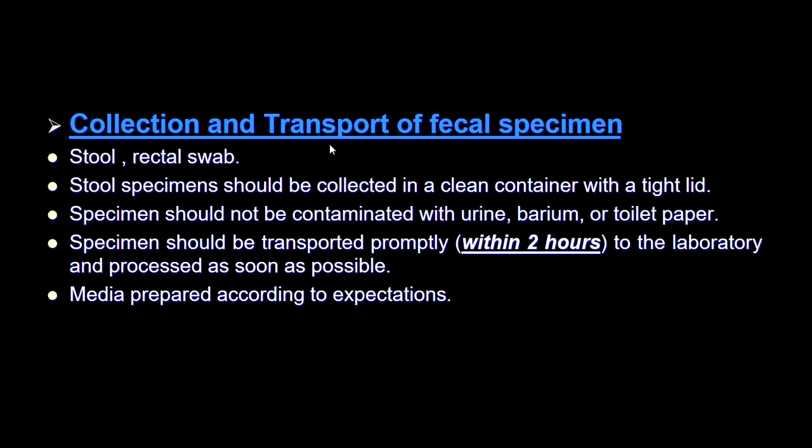It's not just that, but we could take fecal swabs or rectal swabs. You can take them especially in Vibrio cholerae. So it's not just the stool, but swabs. Rectal swabs can be used also to make the diagnosis. So remember that rectal swabs, we use in cases of epidemics of cholera in particular. Then the rule of thumb is to collect the specimen as soon as possible.